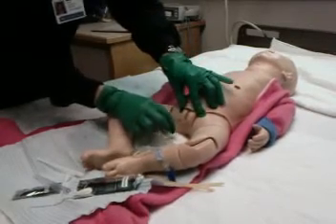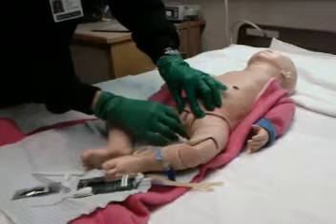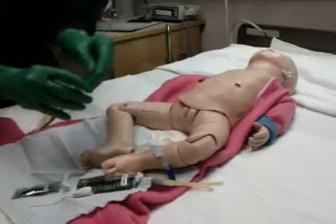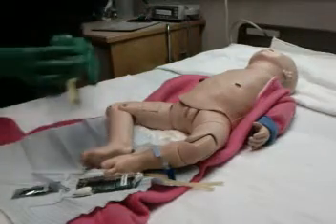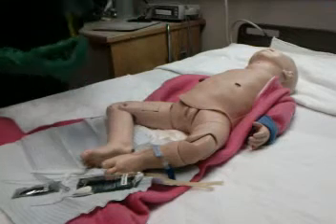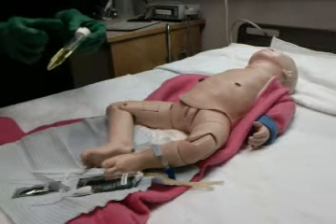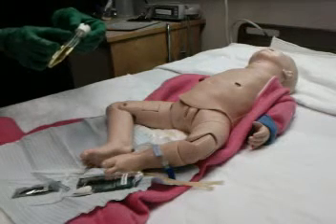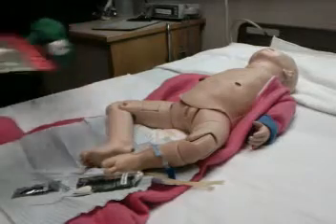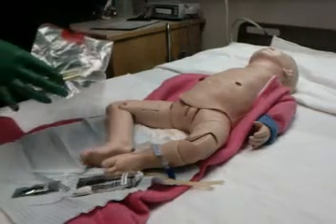You'll notice that there is urine coming back in the tubing. You don't need a full catheter or a full tube — I'm going to withdraw. The baby will probably continue to void or urinate, so that's why you have your diaper underneath. Withdraw the catheter, close this off, tighten your lid, and now you have your urine specimen. So what's missing? You have to put a label on that includes the child's name, their date of birth, your initials, and the time it was drawn. Put the label right on the specimen, include the lab voucher for the actual order, and place it in the biohazard bag — then either tube it or have somebody take it down to lab. Good luck.